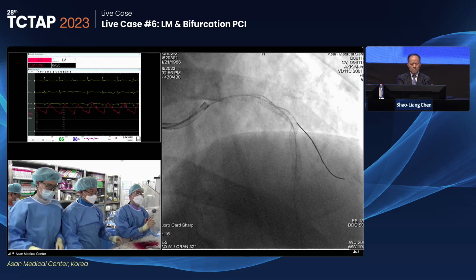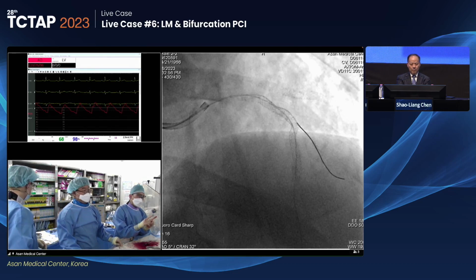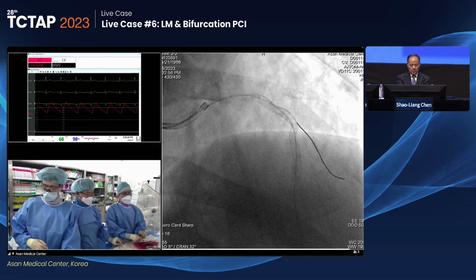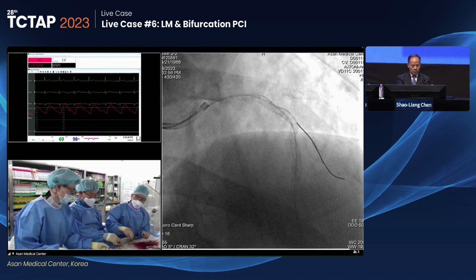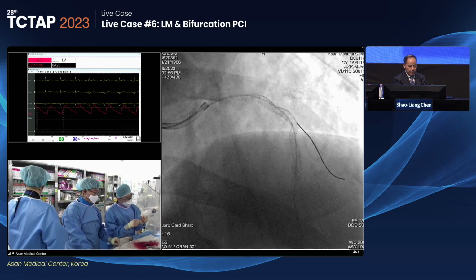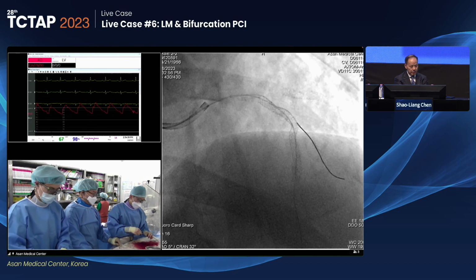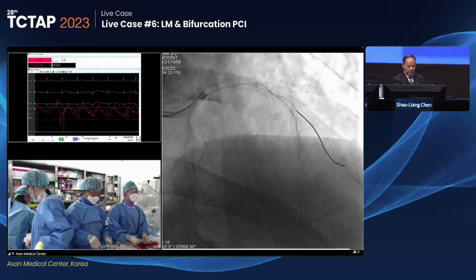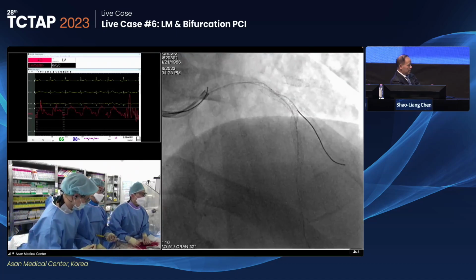There is some interaction between the proximal strut of the stent, the angle, the calcification and the jailed wire that makes some resistance. I can push, but it can cause damage, so I will not. Nothing to hurry, because the patient is very stable. EKG looks good, pressure is fine. I have to measure the left main FFR.